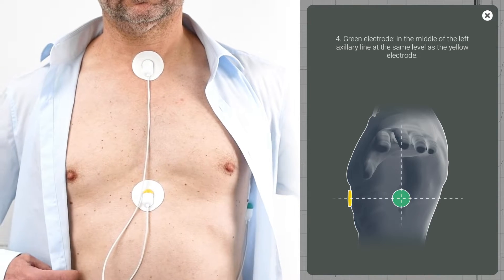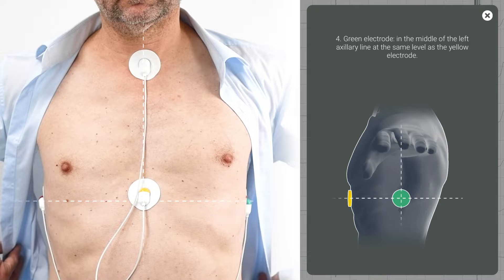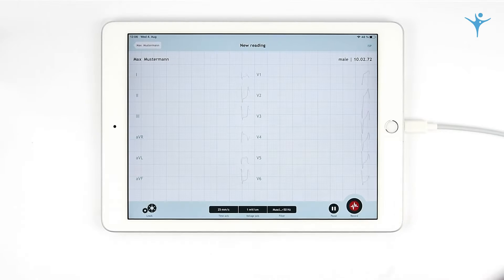The app is now ready to record an ECG. Initially, the view mode will show the following. Simply record an ECG by pressing New Reading. The duration of the recording is shown in the top bar. Recordings can last up to 30 minutes.